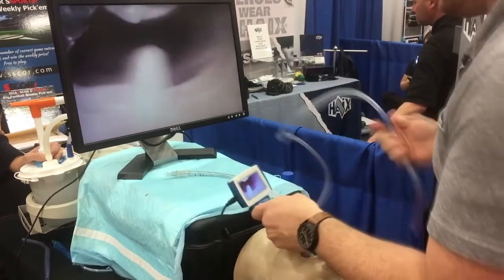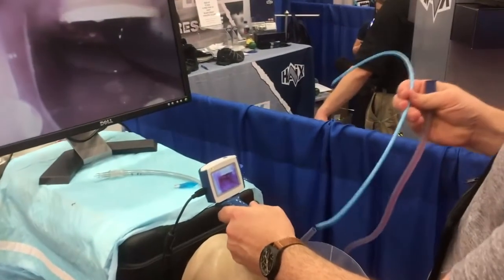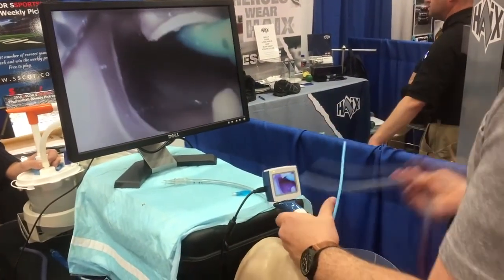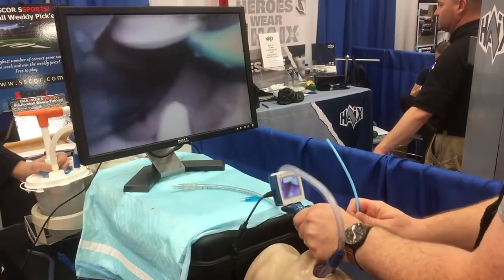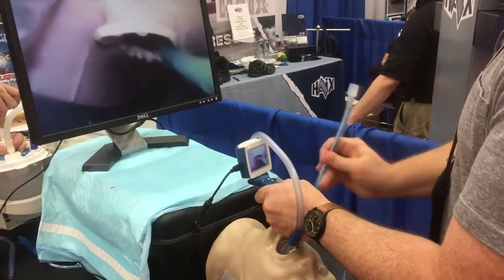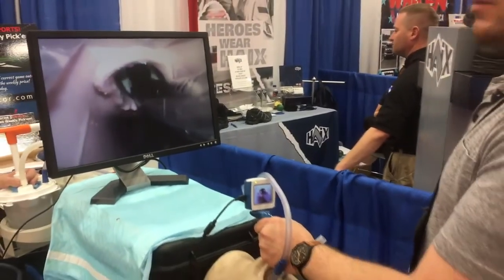He's just going to show an alternative technique now. What happens if you can't get the bougie into the airway? So he's put the sucker into the airway, takes the suction off, puts the bougie down the sucker, takes off the sucker, and then railroads a tube over the top, which is a really nice, novel little technique if you're faced with a catastrophic airway that's either full of vomit or full of blood. So this is called the SALAD technique, and there's a bit of stuff on the internet if you search for it. It doesn't need to use this DuCanto sucker, but it certainly gives a benefit, and it allows that additional step of being able to pass a bougie through this suction device.